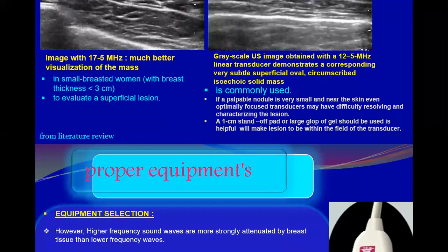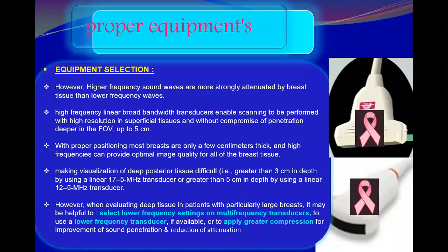Regarding the image selection, as we described in the previous examples, the higher frequency will be good for more superficial lesions, but the breast will attenuate the sound, and the deeper structures might not be visualized by this higher frequency.